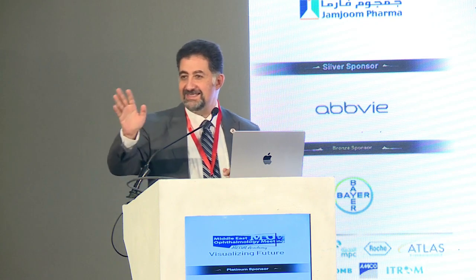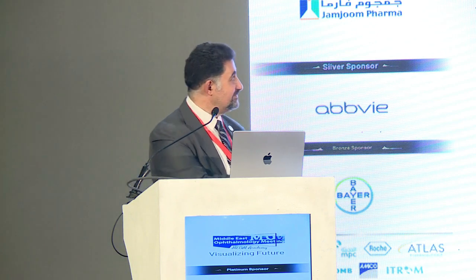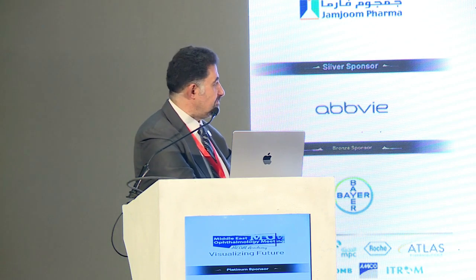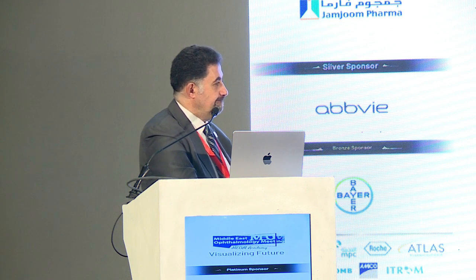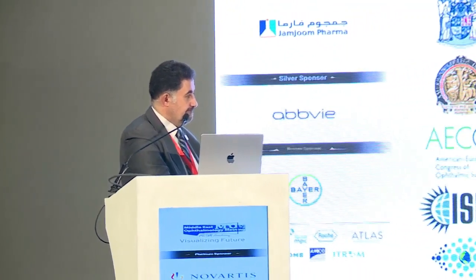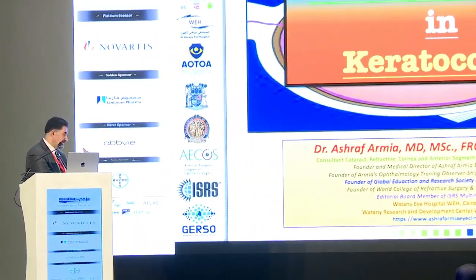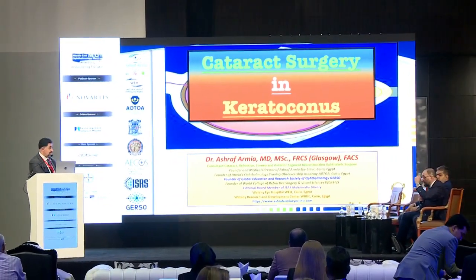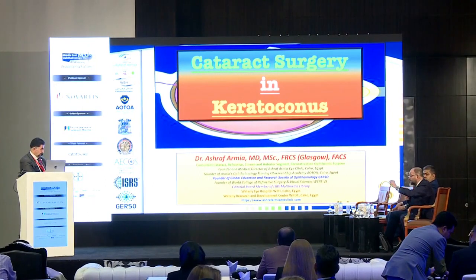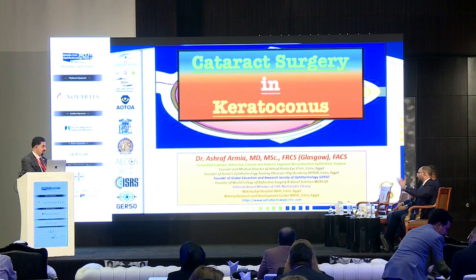Yes, that's right. But we need to know one fact: the vision obtained by hard contact lens will improve all the high order aberrations, everything. So that will not be the vision that he will gain when we put the ICL. Yes, that's totally different. Well, that's what I'm saying. The vision in the glasses that you have is the same vision that you will have. Especially here, we can correct the high astigmatism.